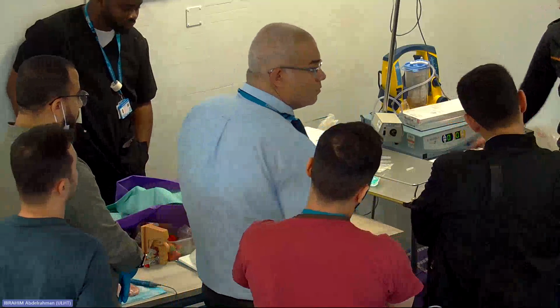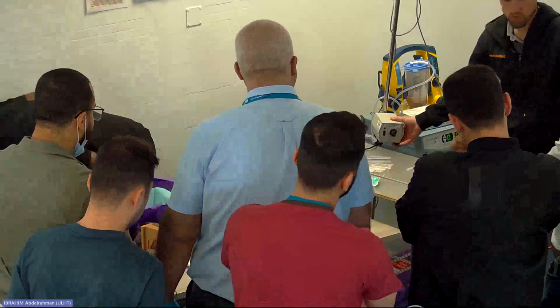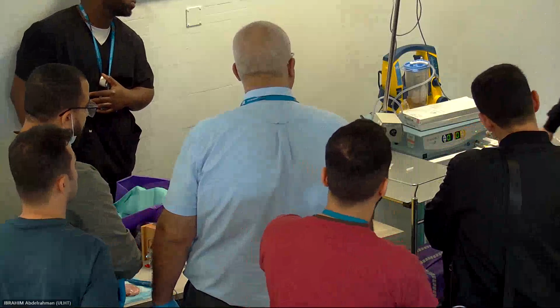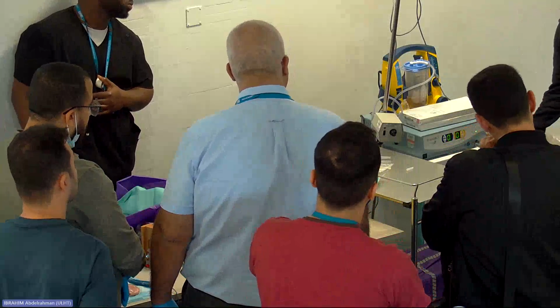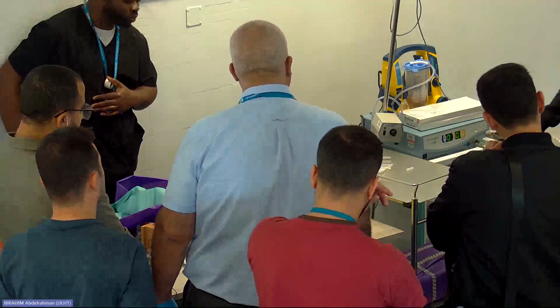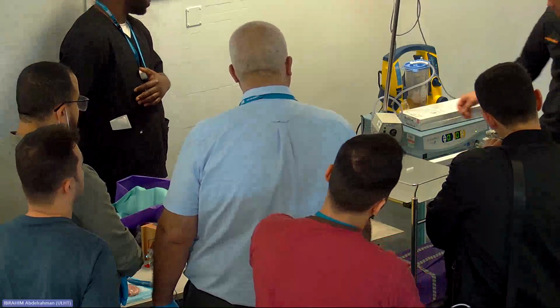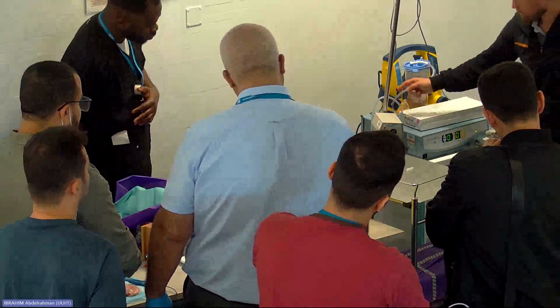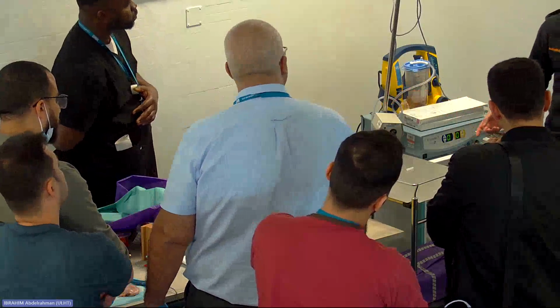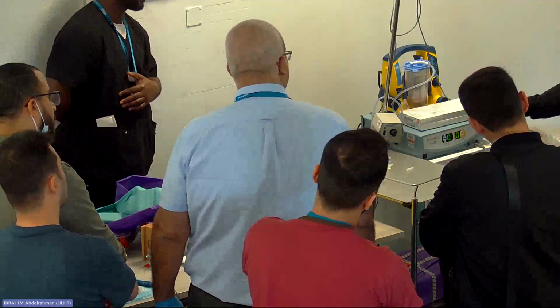You've got the console, the foot pedal, and this grey box, which just controls the flow of the saline. When you switch it on, it should come up with 0 and 0. Nine times out of 10, you'll find the foot pedal is already plugged in. It can only go in one location, so you can't get it wrong. Then you've got this grey cable that controls this switch and powers it. Again, there's only one spot at the back, and the connector is the same at both ends, so you can't get it the wrong way around. Nine times out of 10, when you come into theatre, it'll already be left like that.